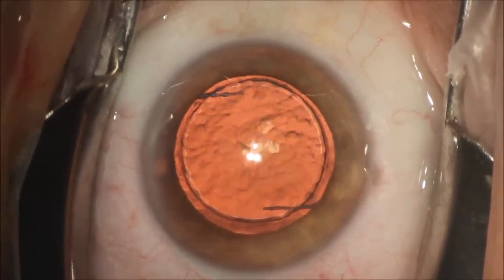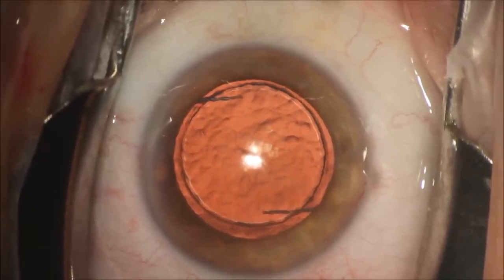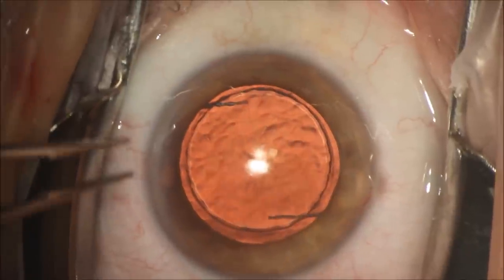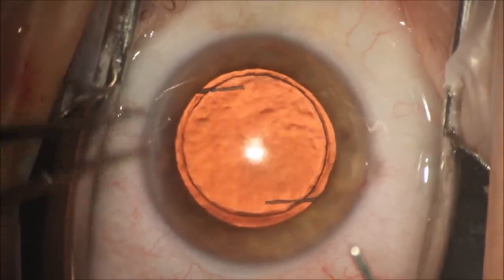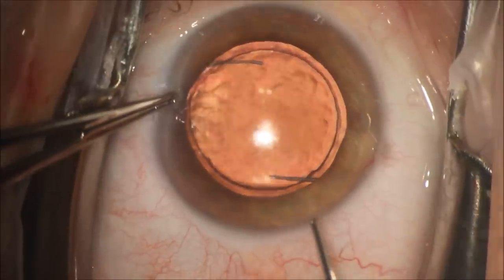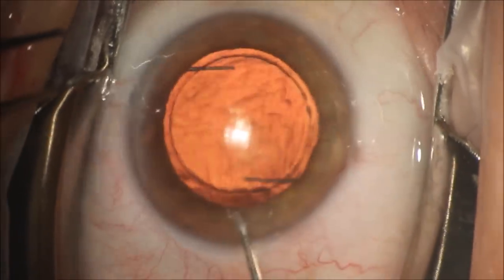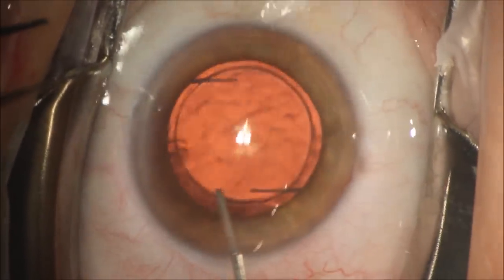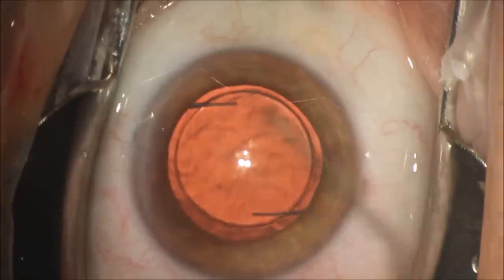I found that up to 6 months after surgery, these can be opened with a cyclodialysis spatula, which is a blunt instrument. We hold the superior paracentesis with 0.12 forceps. It's a very fine forceps, and then we open the clear corneal incision with a blunt spatula. As you can see there, we do not need to cut this again.